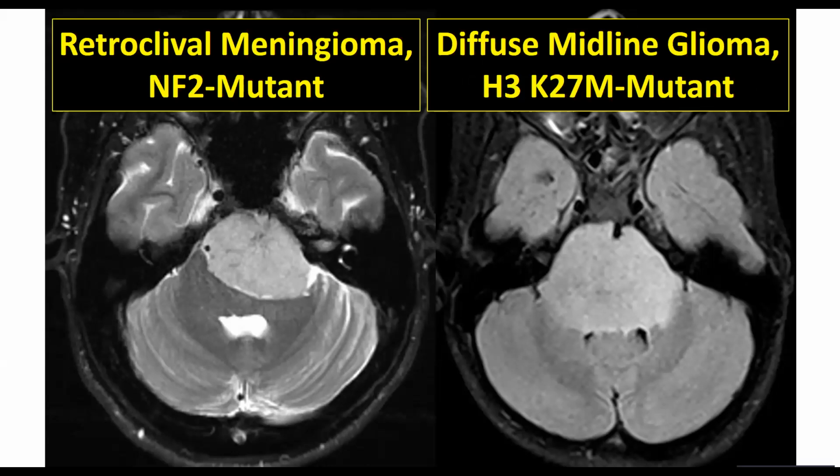Behind the clivus where the pons is, and a pontine glioma, diffuse intrinsic pontine glioma. In this particular case, proven diffuse midline glioma, H3K27M mutant. All right, now that's kind of an elementary, but basic mimic. But I thought it was very important to put it in here because I'm sure at least if even one person attending this conference looked at that and thought that pontine glioma is the anatomy, et cetera, then it's been worthwhile. It's been a good conference.